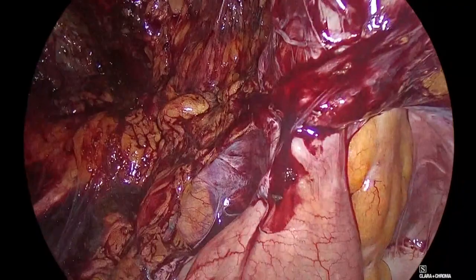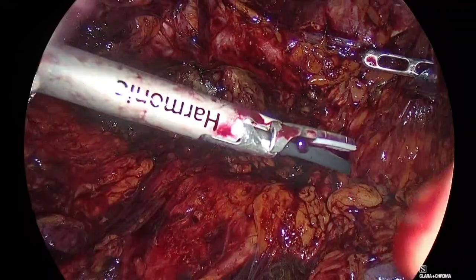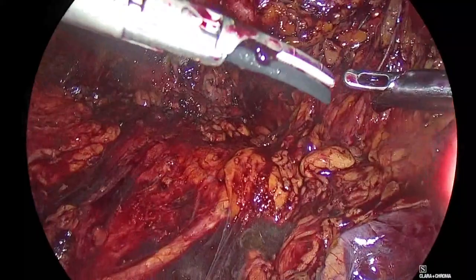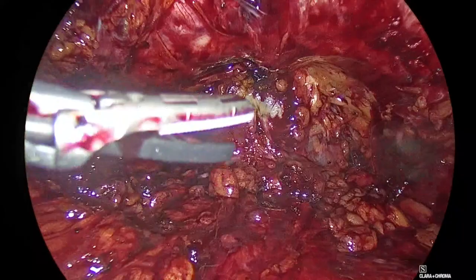Okay? So I need to be very careful with my trocars going in. The way I put the trocars in this case is I don't put them in blindly. I will show you more or less. I put a strong grasper where my harmonic is. I create a small window on the wall, and then I push the grasper towards the skin. So then I cut the skin, and I proceed introducing my trocar. Give me bipolar, please.